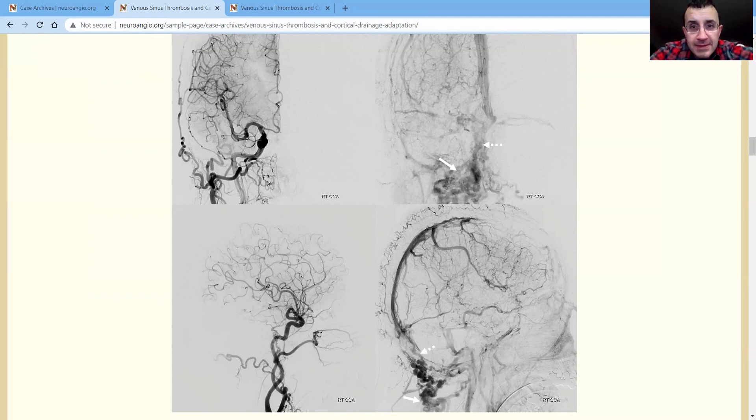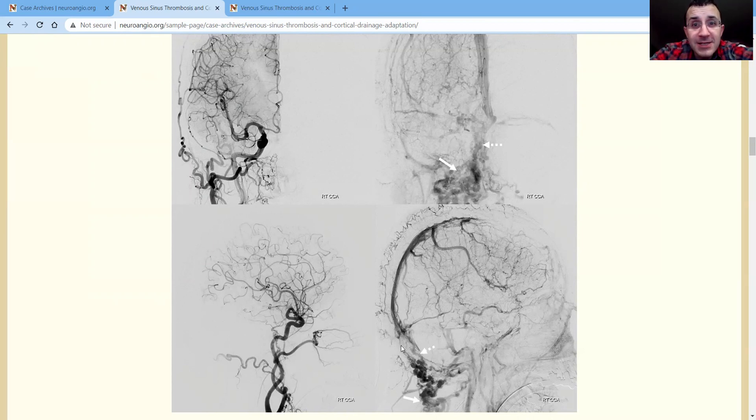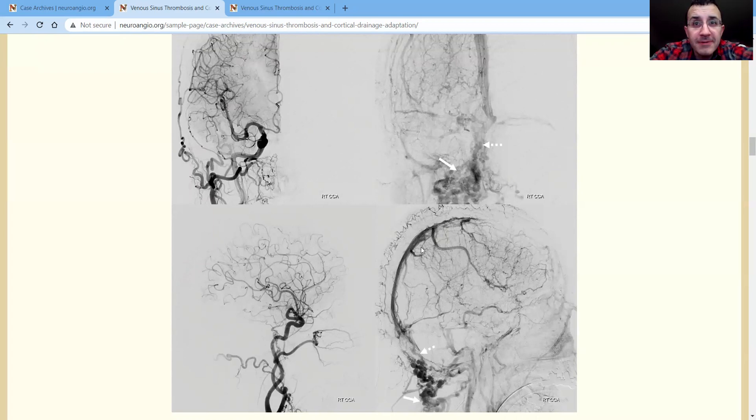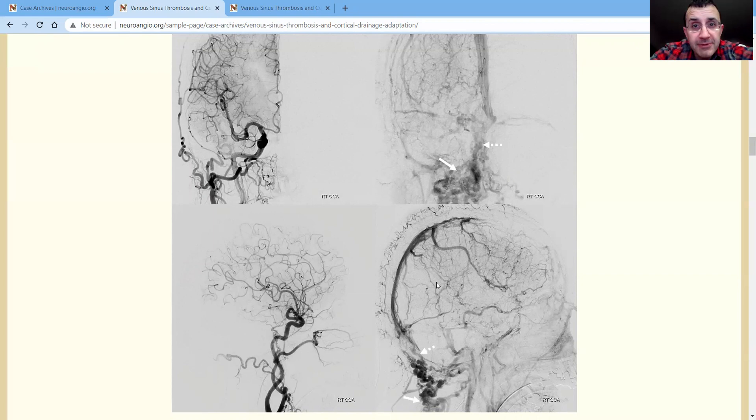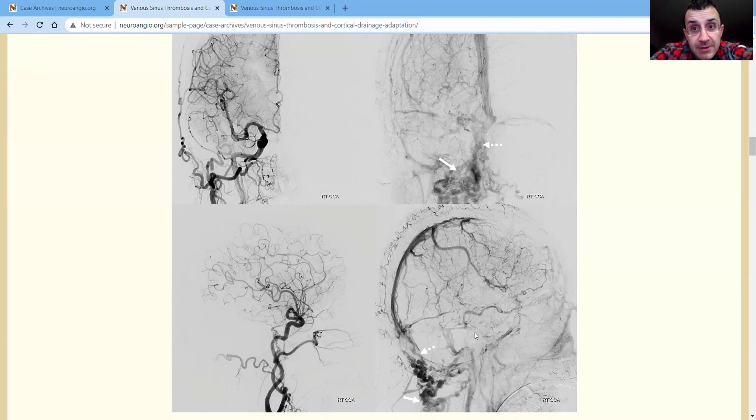And this is a brain-saving hole right here because essentially all of that superior sagittal sinus drainage goes through this channel and that decompresses into the cervical veins. That's one of the reasons why she's doing so well. So we have to understand that. It's very important. Now, what's happening with the rest of the hemisphere? Obviously the Trolard was the dominant thing in her. That means the sylvian veins here are developmentally hypoplastic. You don't see much of the sylvian system.